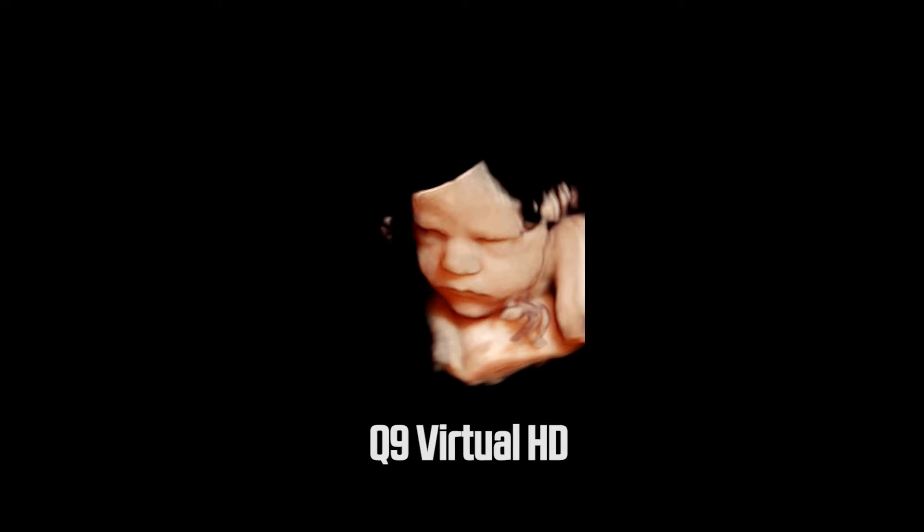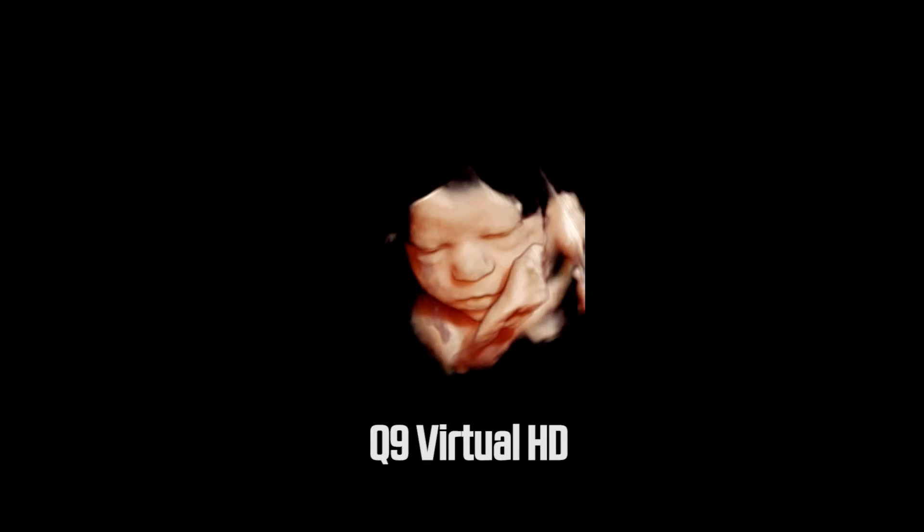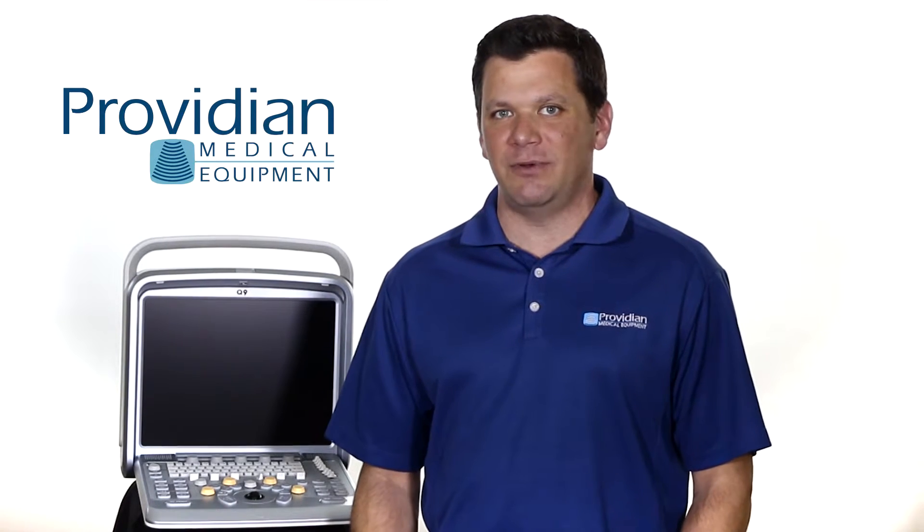As you can see, this has the ability to get excellent images. But in my opinion, the Q9 is not a Voluson E8 and most of the time it will not perform like one. It has the ability to get great images as you've just seen, but doesn't have nearly as many tools to optimize the image. In general, the E8, which is much more expensive, is just better.